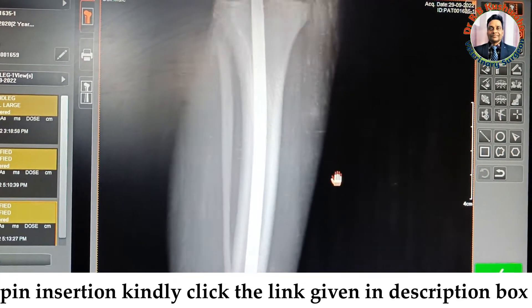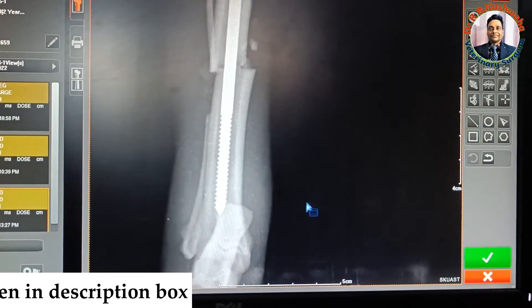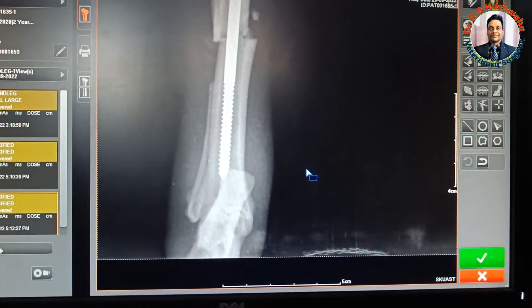Take care — by both views, we could say that the pin has been exactly placed inside the medullary cavity of the distal fracture fragment.